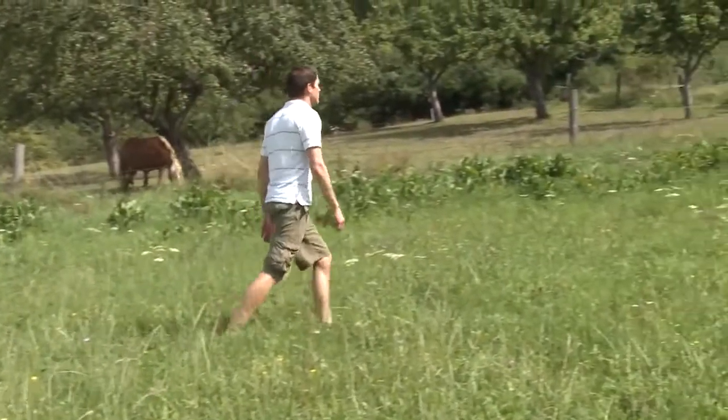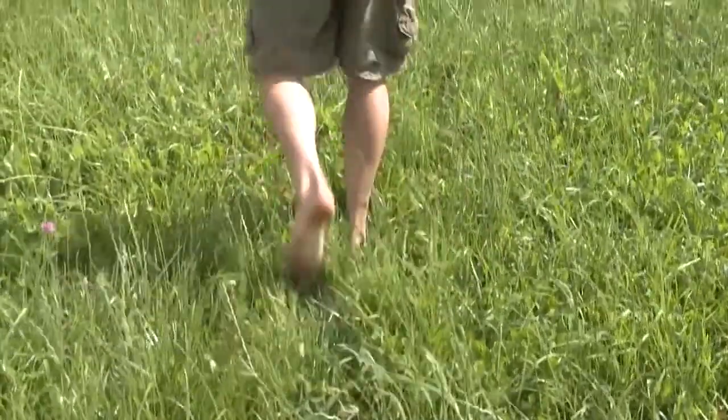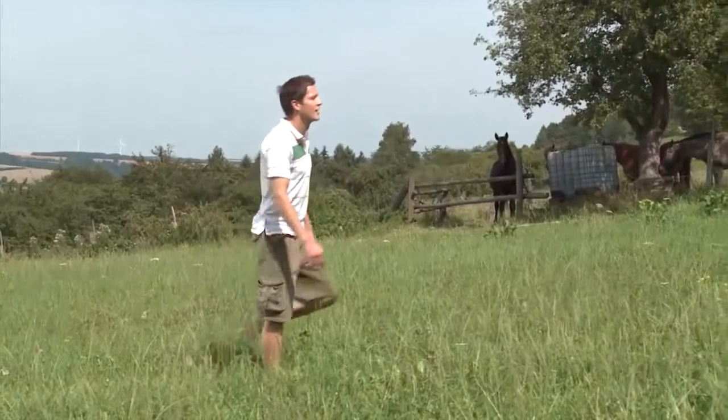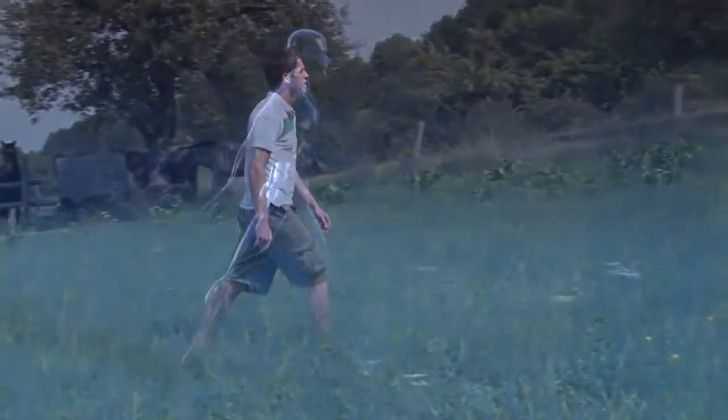In order to understand the Sea Leg, it is best to start with nature as a model. Walking is such an automatic function for us that we do not have to concentrate on it. Yet numerous complicated processes occur every time we take a step.